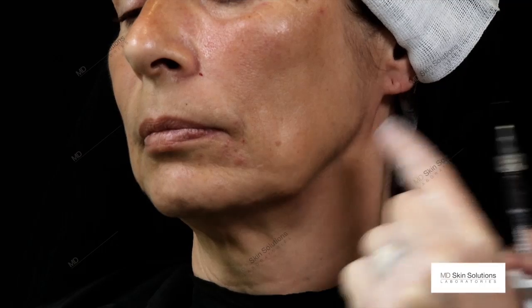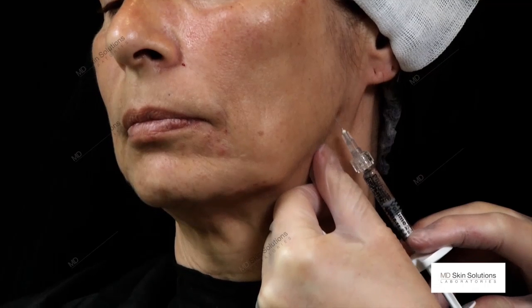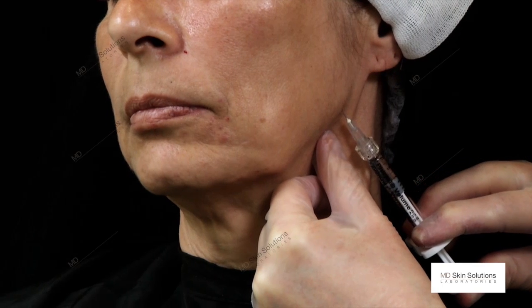For the redefinition of the upper part of this angle, I choose the same entry point and place filler in a retrograde fashion in a fan-wise way.